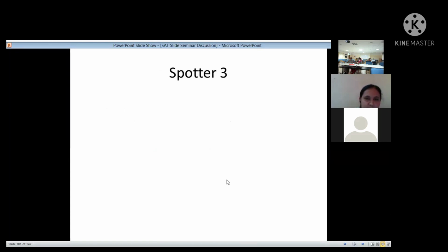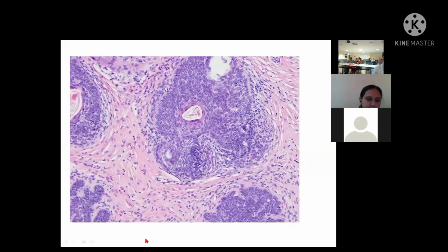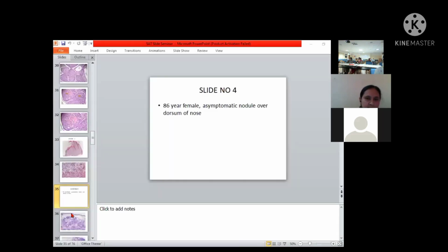So can we move on to our next spotter? Yes, ma'am. So what do you think it is?